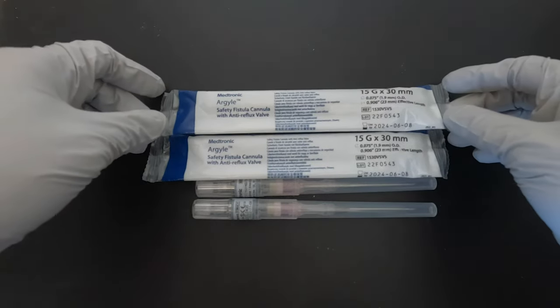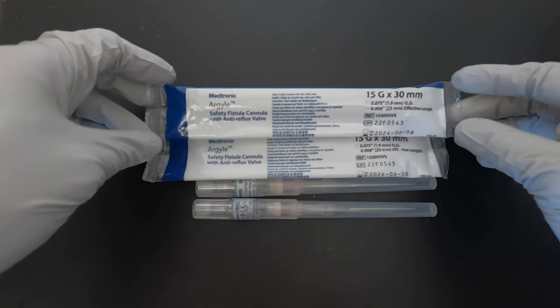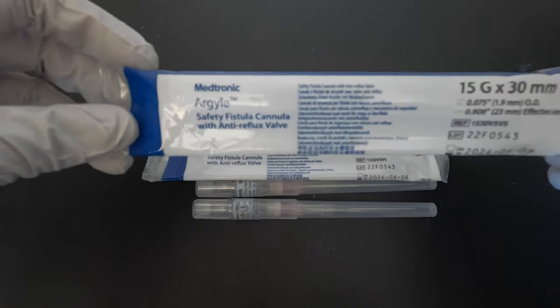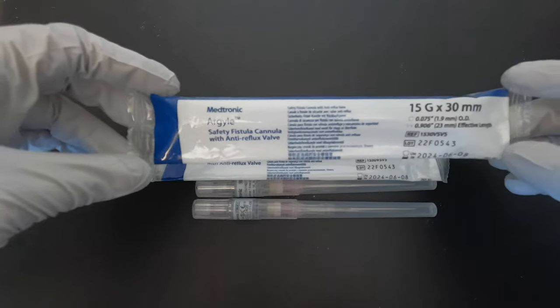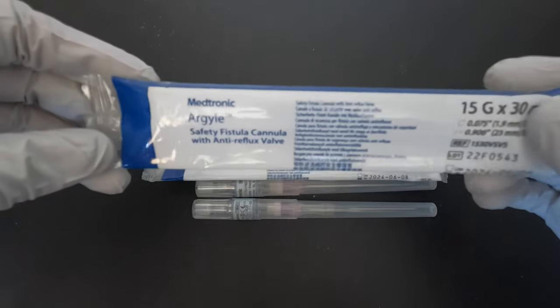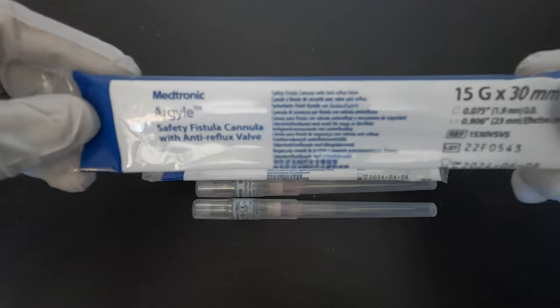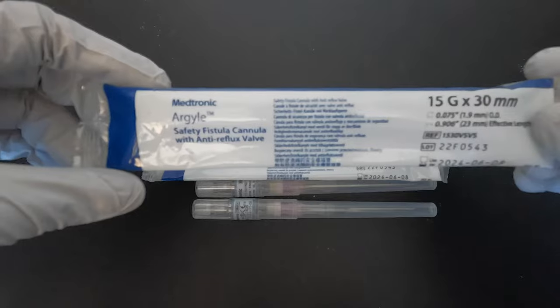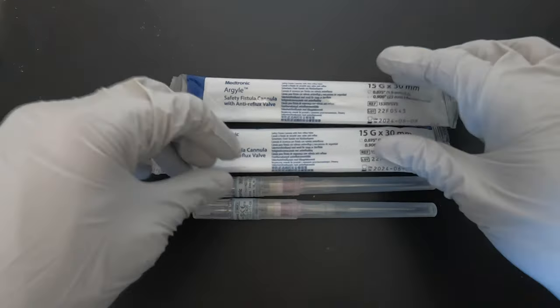Hello guys, today we will discuss the Argyle needle for hemodialysis. This kind of needle is different from your traditional steel needles. It is available widely across other countries but it's not being widely used because it's more expensive than steel needles. However, it has better outcomes for your AV fistula and AV grafts, especially for newly created HD access.